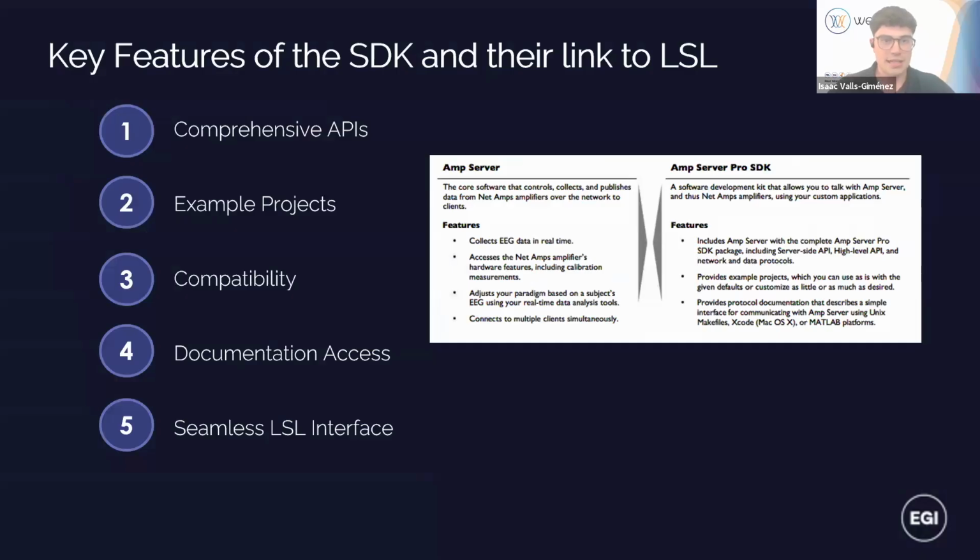Before we dive into the actual connector and the applications that you can use with the LSL interface, I'm going to start with a quick overview of what the SDK is. The SDK is our software development kit for the AmpServer Pro, and I want to introduce this to then link it to how LSL helps. The SDK is essentially what allows you to interface directly with your Net Amps, the server of your amplifier, and it makes it possible to access, record, and visualize the data.